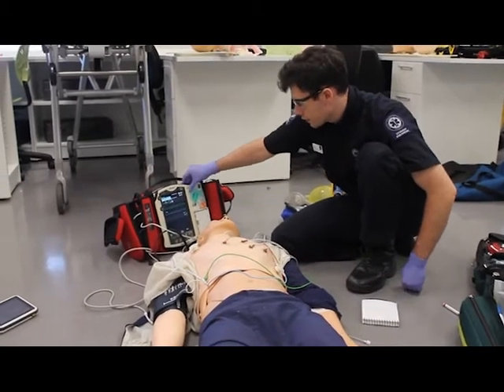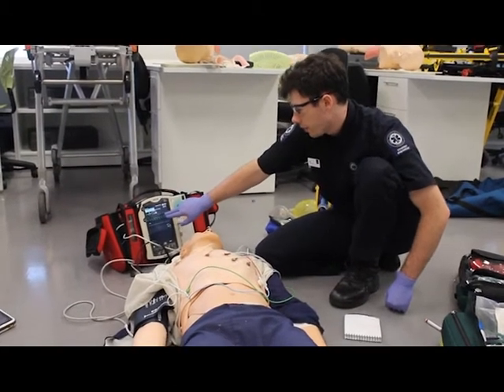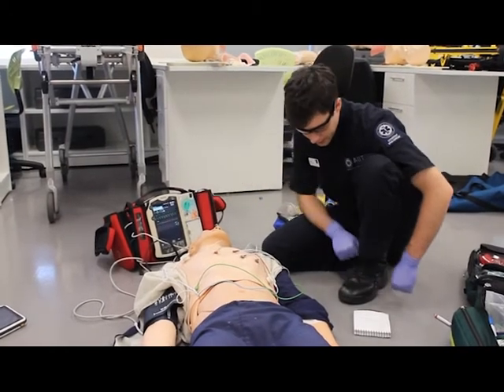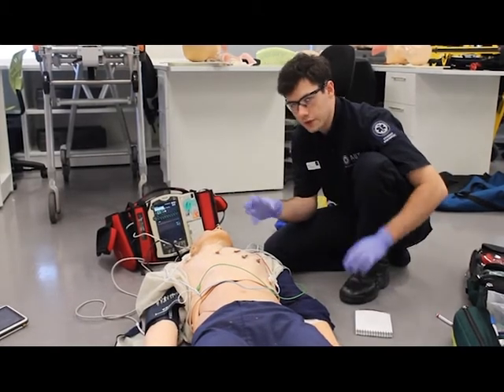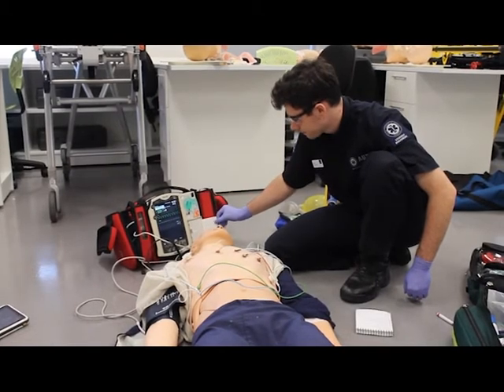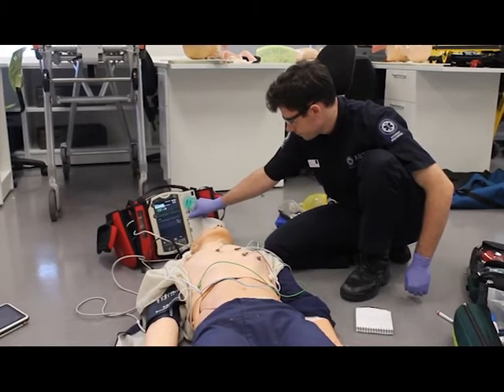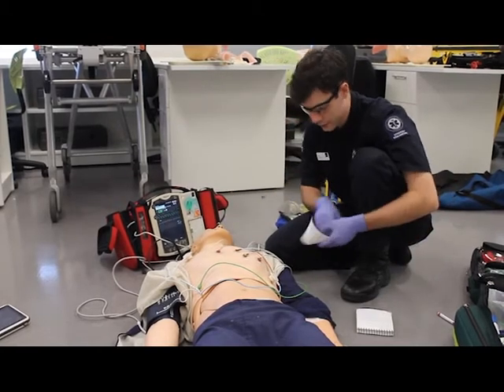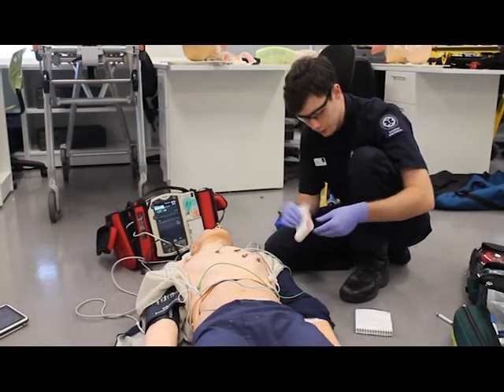Then I'm going to select the synchronized mode on the monitor, and that's going to put a little mark above each of the QRS complexes in the patient's VT rhythm. I'm just going to confirm that we've got that synchronization going by printing a quick strip. Yep, so we've confirmed that on the printout as well.